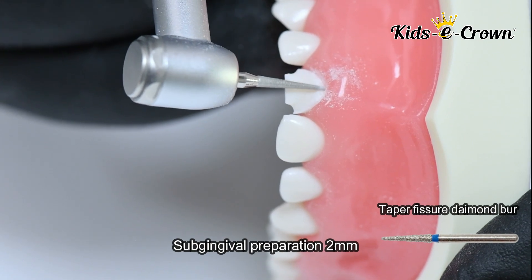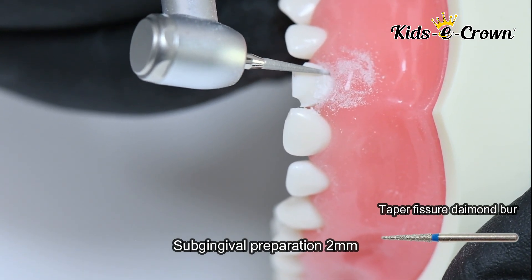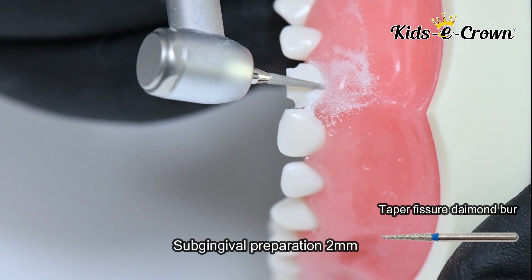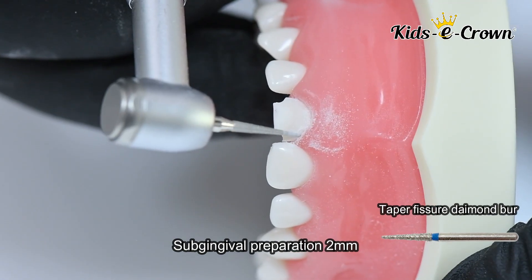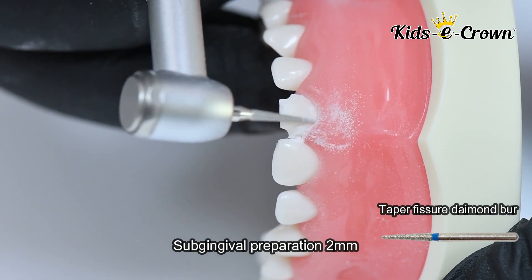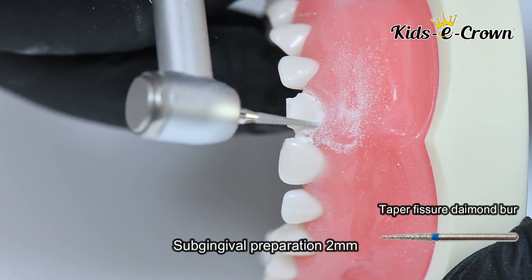In Step 3, you take a tapered fissure burr, go 2 mm sub-gingival, and remove the finish line on all 4 sides. Basically, the finish line is your road map to achieve equal preparation on all 4 surfaces of the tooth.